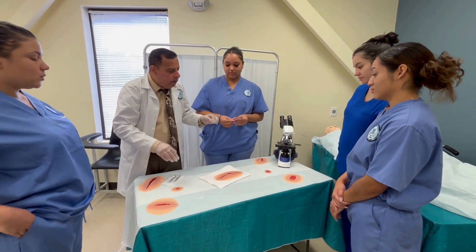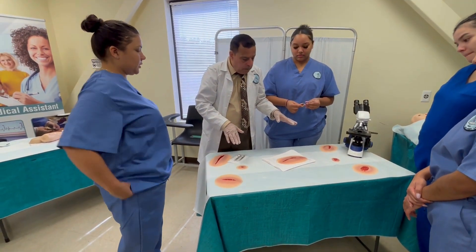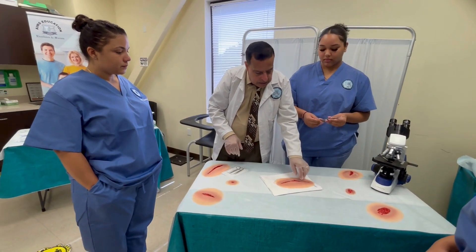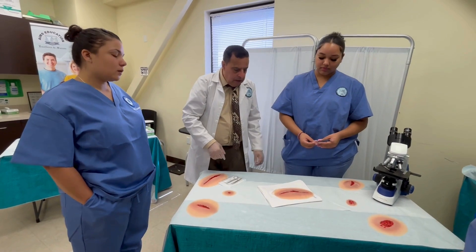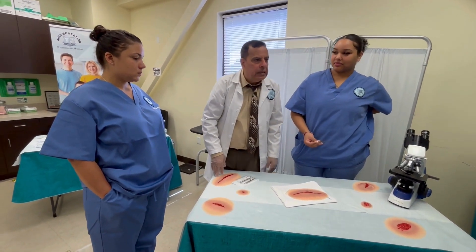You only cut on the outer layer, not the inner layer, because that is where the suture is connected. You pick it up from the middle and remove it. This is how to remove a suture, and sometimes the physician will ask you to do that.